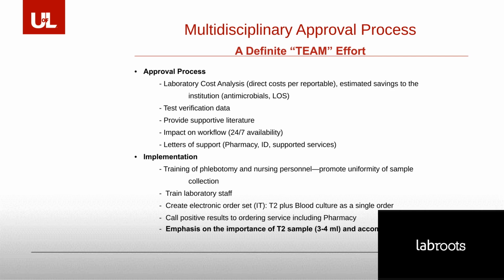And these tests are done as soon as they come in, i.e. stat, around the clock. And then we obtained letters of support from our major team players: pharmacy, bone marrow, pulmonary, and so forth. And as a result of that, all these added up to us being able to present and acquire the instrument for use. So once the instrument was approved by the administration, we now needed to implement it.